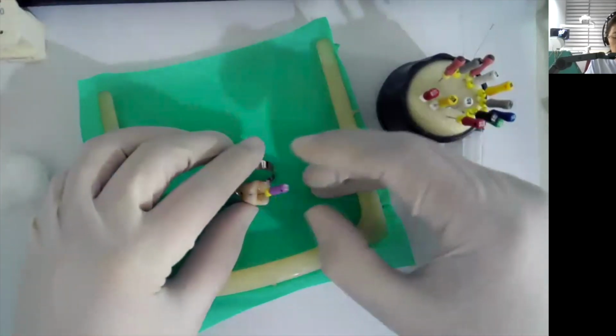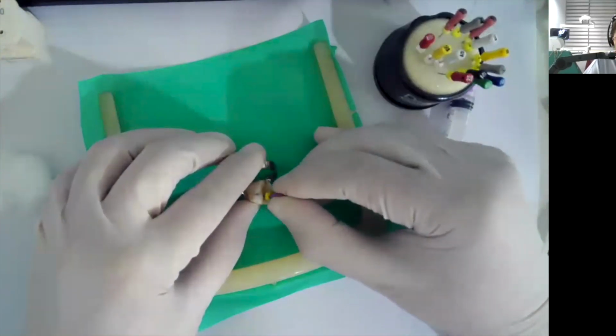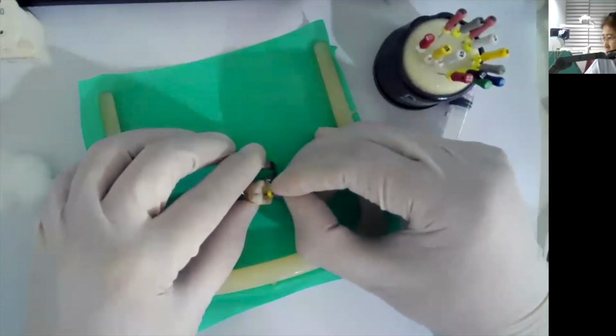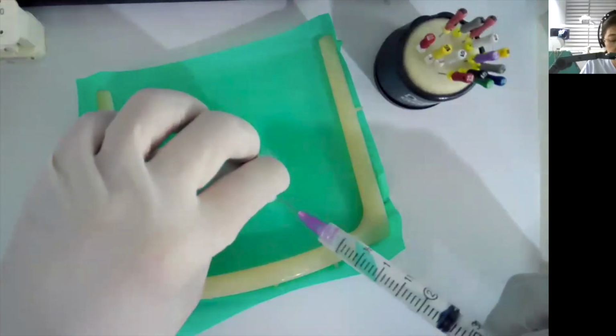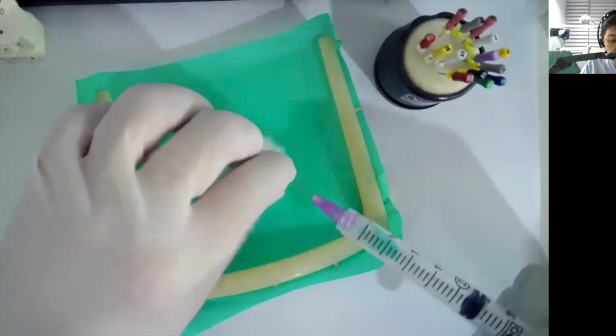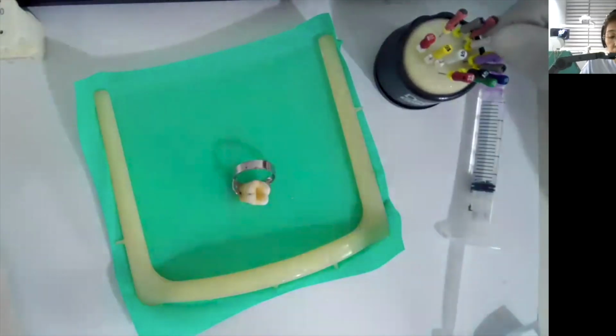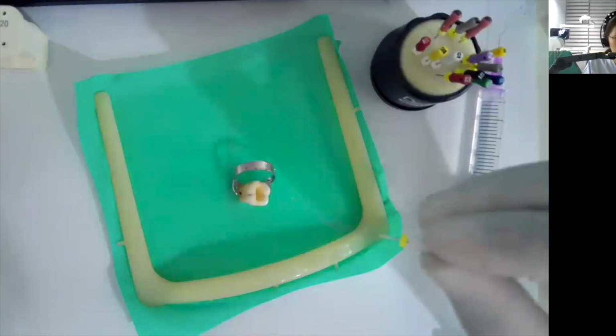and then insert and then do watch winding. So make sure this is loose. Irrigate again until the irrigant is already clear. And then I'll start to use size 15, still measured at 22.5. Okay. Put some EDTA on it.